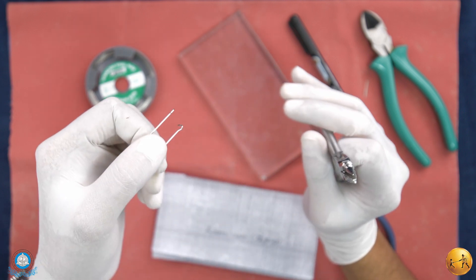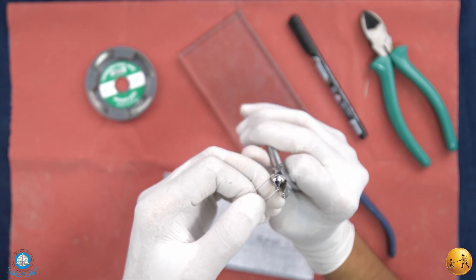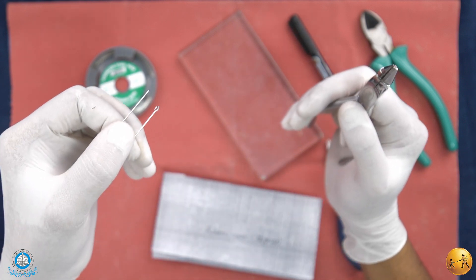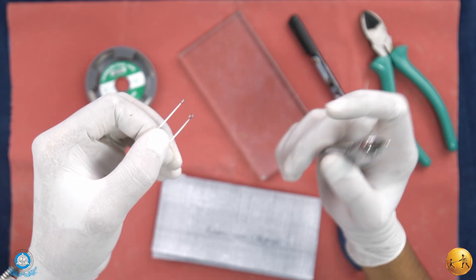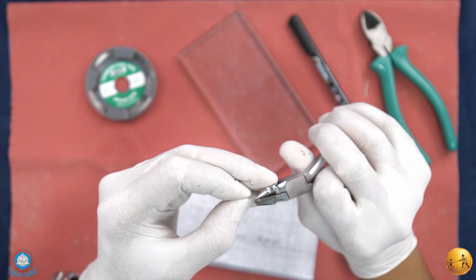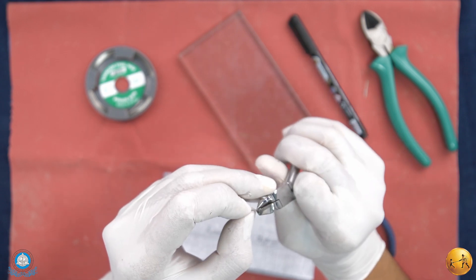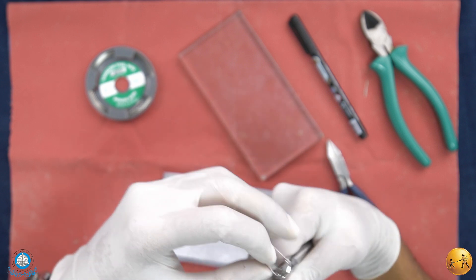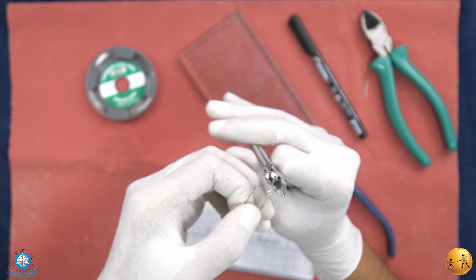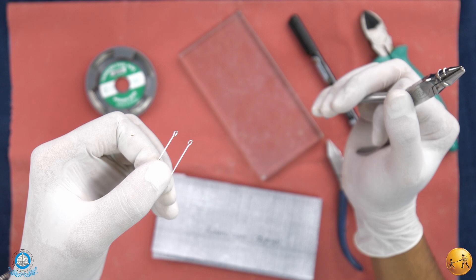Against the square beak of the plier, give it a small indent, then compress the two ends together to form the loop. Repeat the same procedure on the other side: make a uniform U, create an indent against the square beak, and compress the loop.